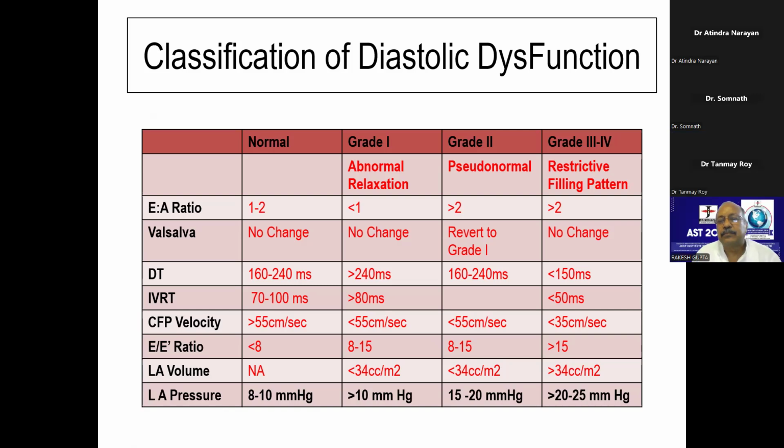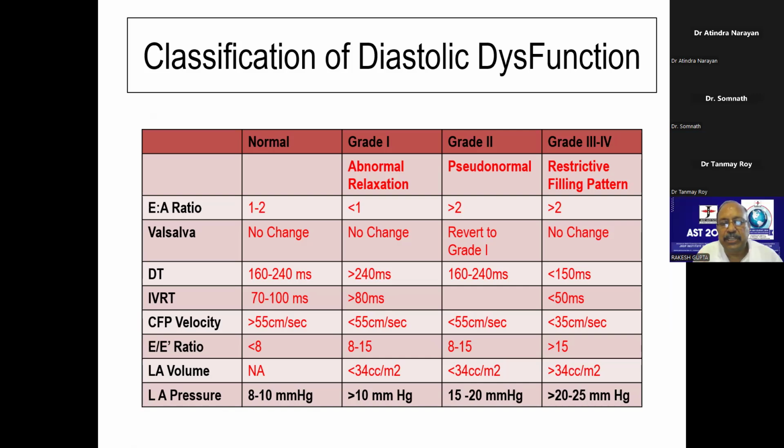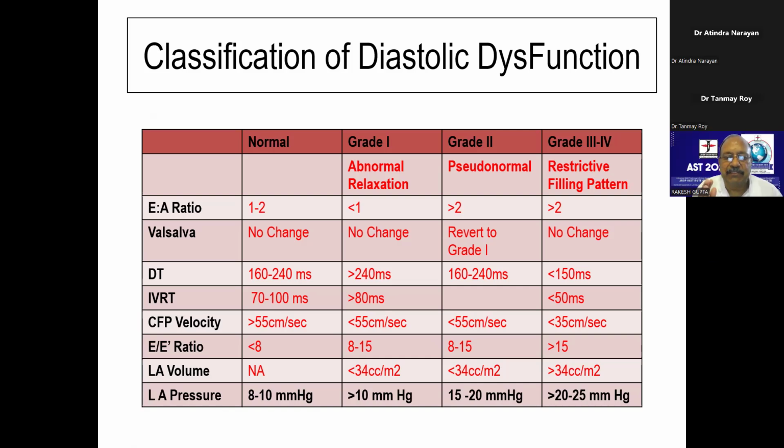Sir, we will need medication to decrease the left ventricular end-diastolic pressure. Say it again, I'm not able to hear, talk a little louder. Sir, we need medications to decrease the LVEDP, left ventricular end-diastolic pressure. Possibly you joined late in the session. I said when we are looking for a diastolic function evaluation, it is synonymous with left ventricular end-diastolic pressure, LA pressure, left ventricular filling pressures. They're all synonymous at your level. So I've shown you left ventricular filling pressures which are elevated, 15 to 20.